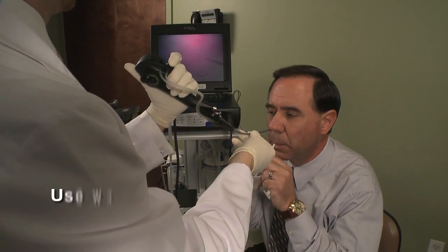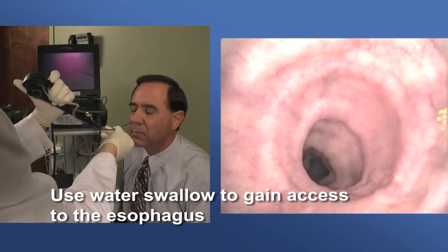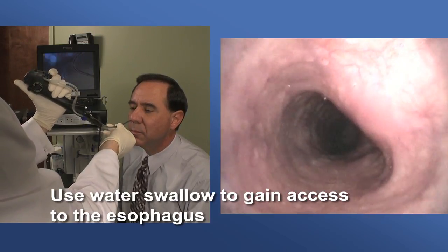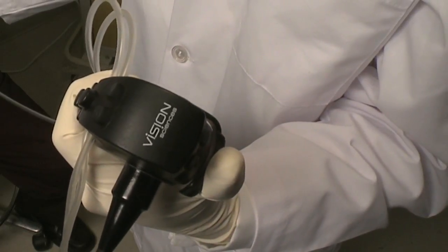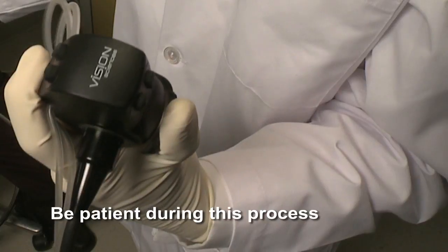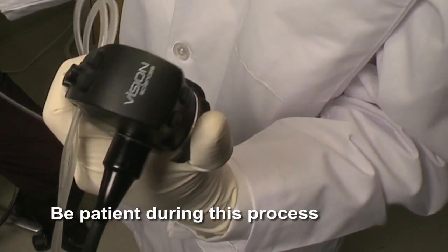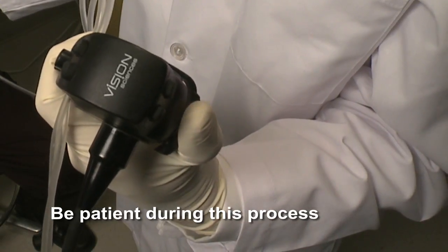Patients are typically asked to swallow water through a straw. During the swallow, the endoscope can be advanced into the esophagus. Advance the endoscope through the esophagus towards the GE junction. To insufflate the esophagus for better viewing, slowly tap the air button when needed. Be patient and do not over-utilize the air insufflation, as too much air can produce patient discomfort.